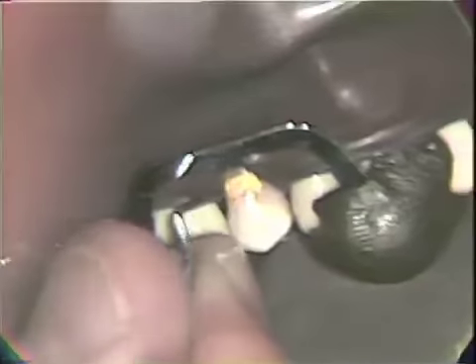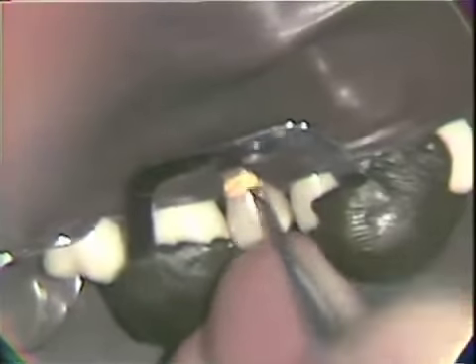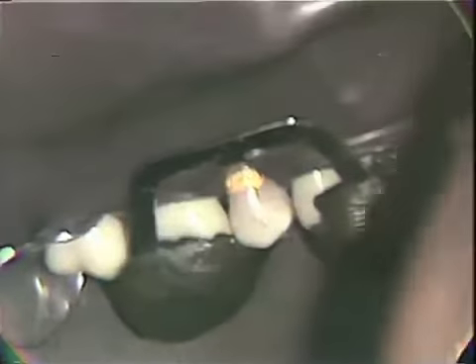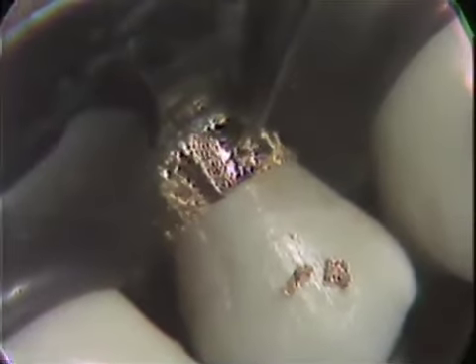We're taking off any of this excess material that extends beyond the margins, getting rid of that so that we can maintain the general position of that external outline form. We'll lay another piece of foil into that area, get it to place, and carry on then with condensation.